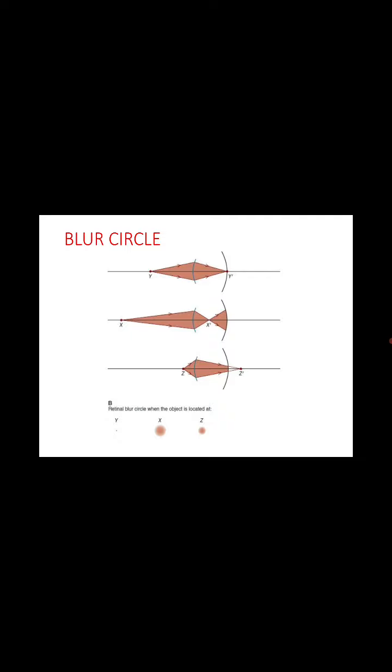As we know, pinhole reduces the blur circle and it does not work on the basis of the Stiles-Crawford effect, because many students I have taught confuse it with the Stiles-Crawford effect. Pinhole does work, but it doesn't work on the basis of Stiles-Crawford 1 or Stiles-Crawford 2. These are different things, and it works on the basis of paraxial rays, which is written clearly in the Essentials of Low Vision book.